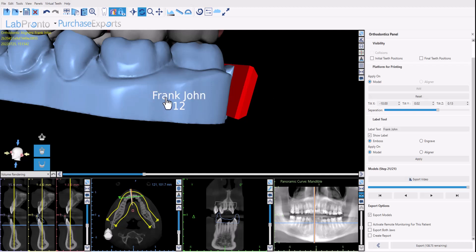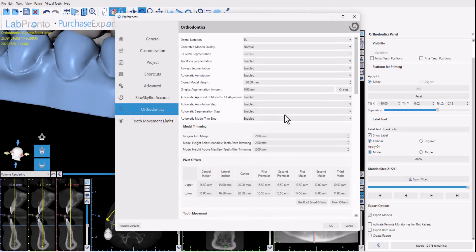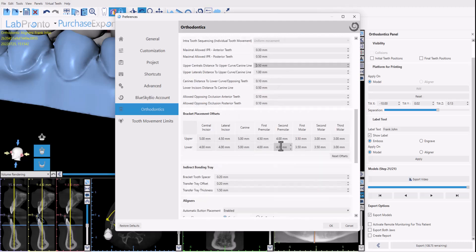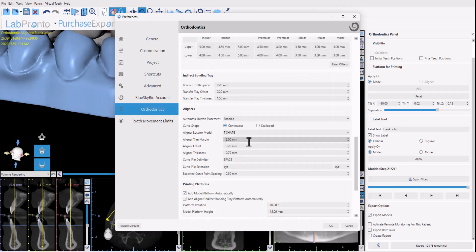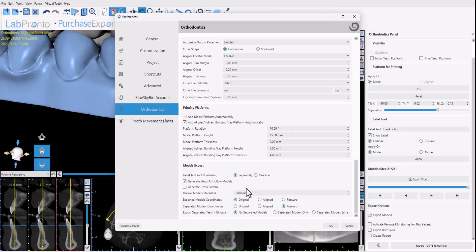And if you want the text and the number to appear in the same row we have that option as well. You could go to Tools, Preferences, Orthodontics over here and just scroll down to the bottom. And we have label text and numbering. Right now it's separately which means it's on two different lines or you could put it on one line and then it will be on one line as well.